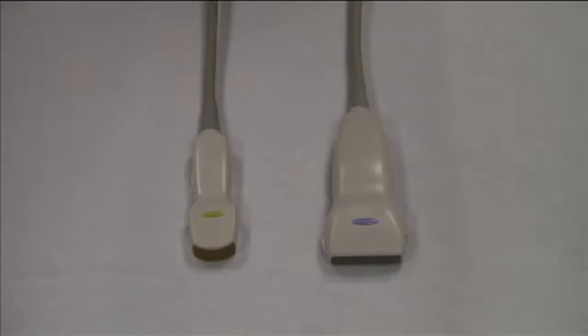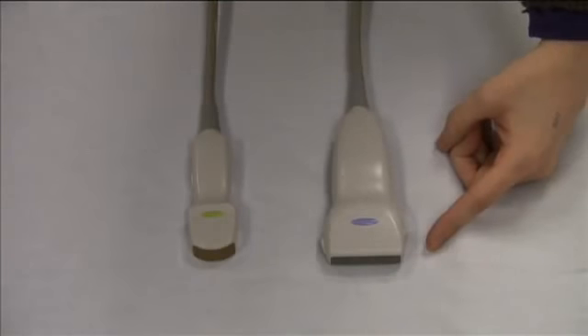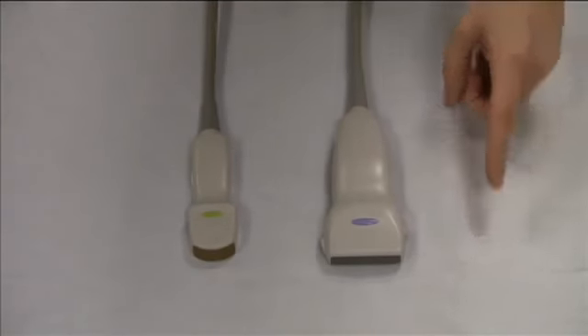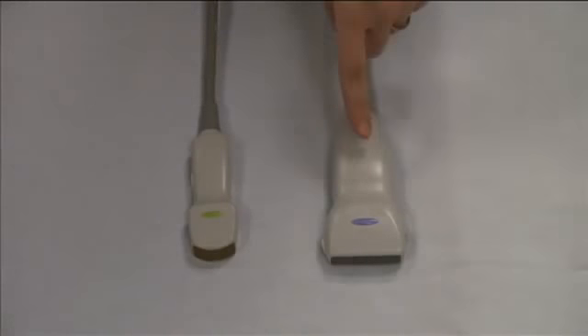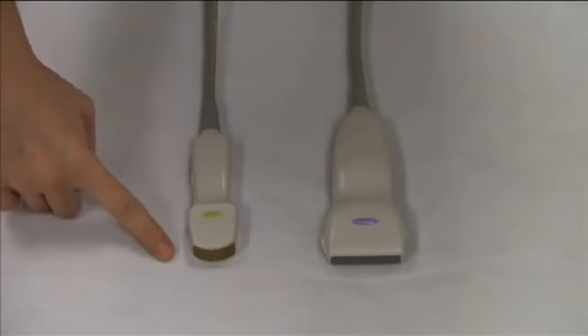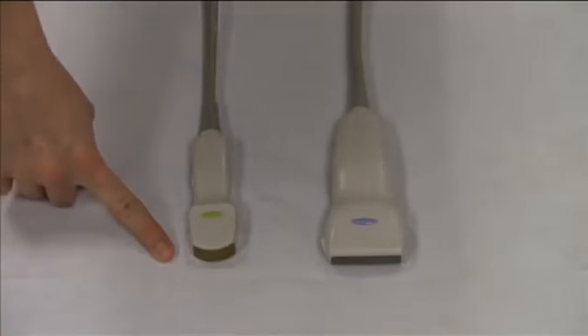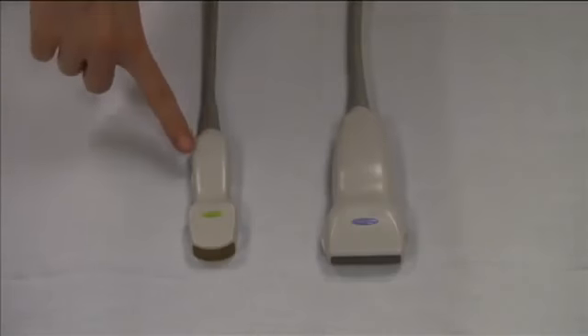In general, linear transducers are better for scanning superficial structures — they have better resolution of superficial things. When you scan your wrist to find your radial artery, you will use the linear transducer. Curved transducers are typically better for deep structures with better deep penetration resolution. When you scan the abdominal phantom, use the curved transducer.